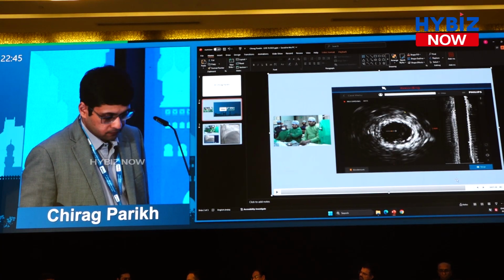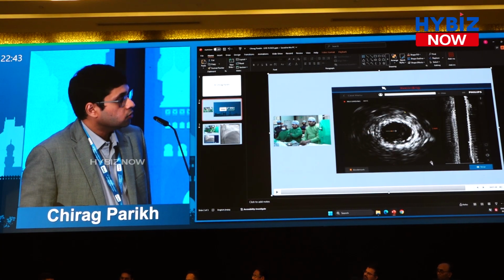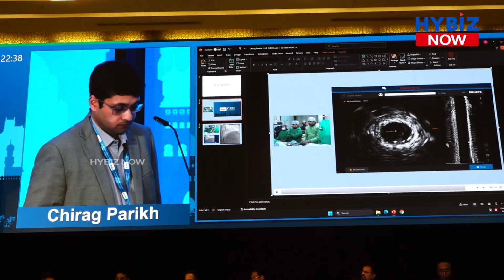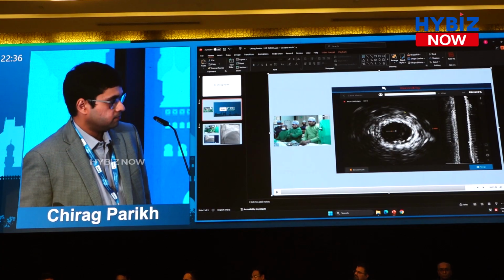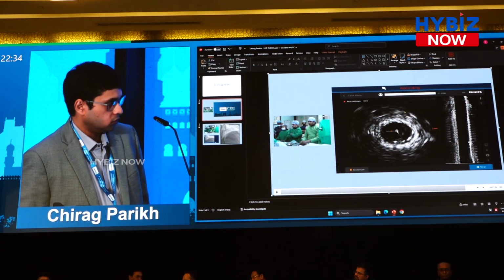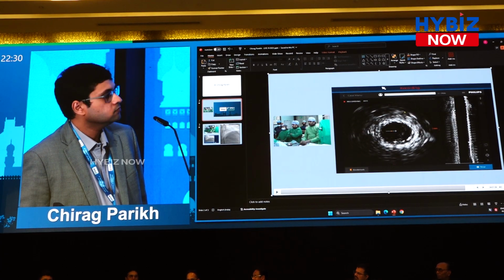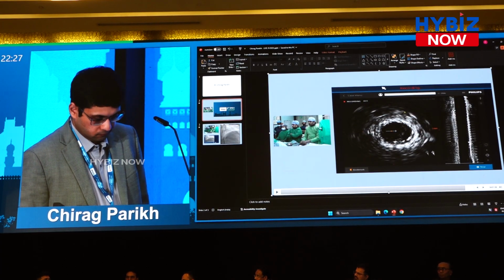It can be a lipidic plaque or some form of spontaneous coronary dissection in this young patient. Dr. Chirag, when did he undergo the first angioplasty? Four years back, in 2021. So it could be neoatherosclerosis, which behaves like an accelerated atherosclerosis, could be a plaque rupture. So the most important thing is the timeline. If the patient is coming to you in 1 year or 2 years, you should start thinking about NIH.